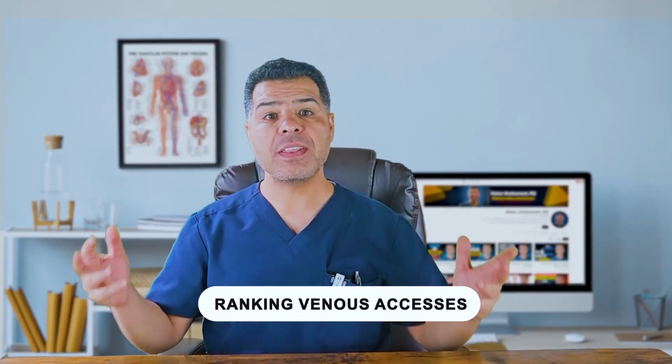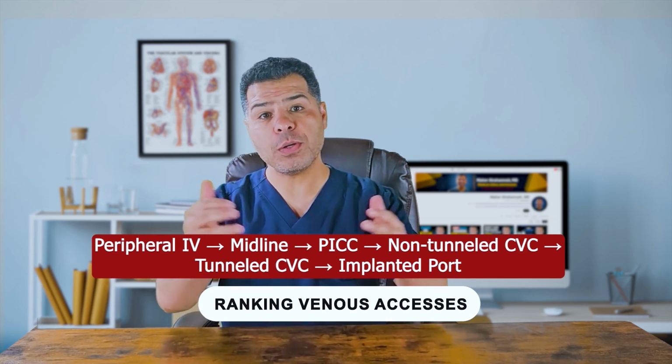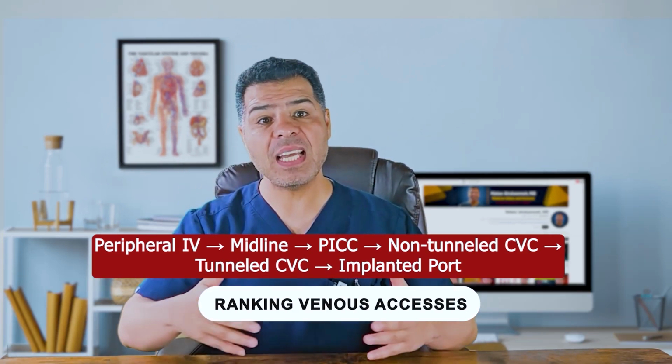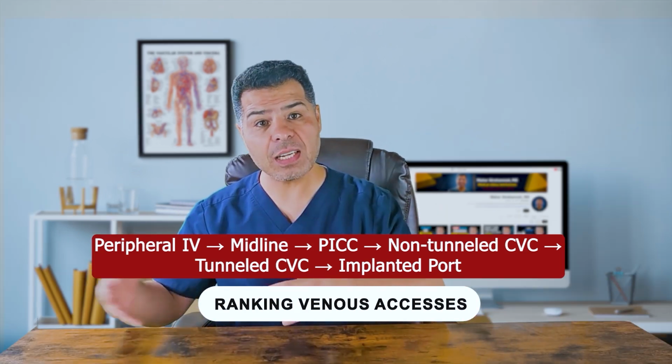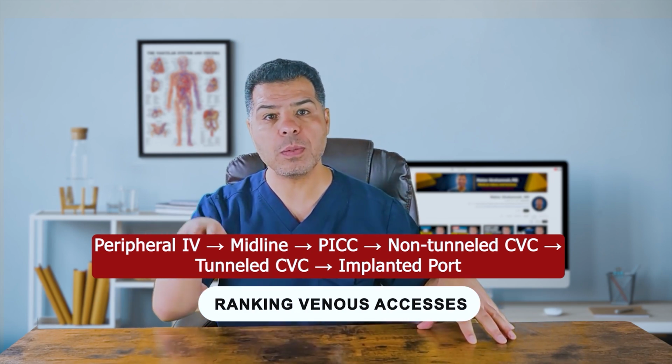Let's first rank them by how invasive they are. The least invasive is a regular peripheral IV, then comes a midline, followed by a PICC line, then a non-tunneled central venous catheter, then a tunneled central venous catheter, and finally the implanted ports as the most invasive.